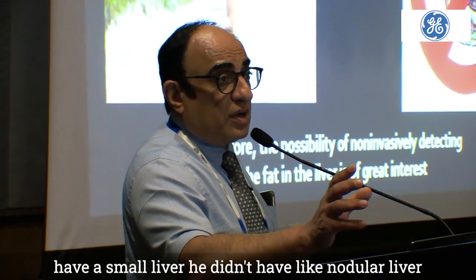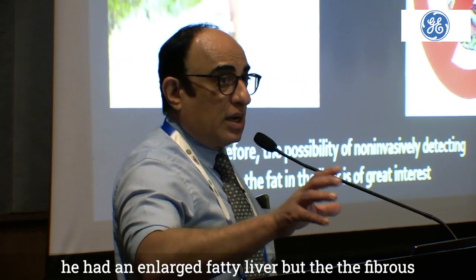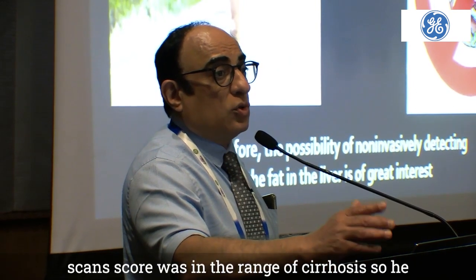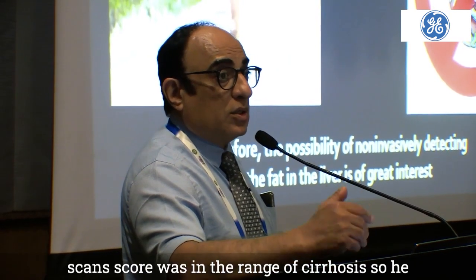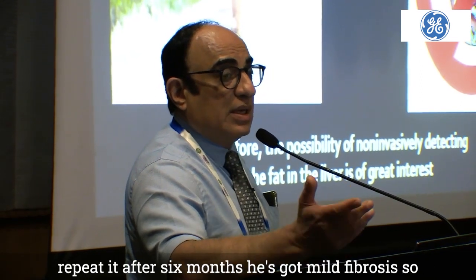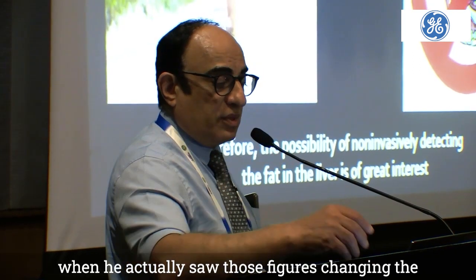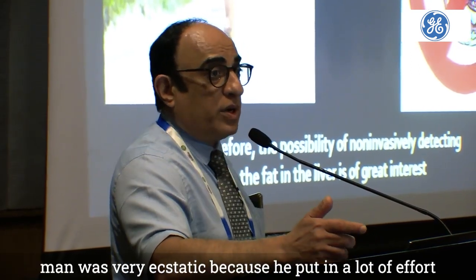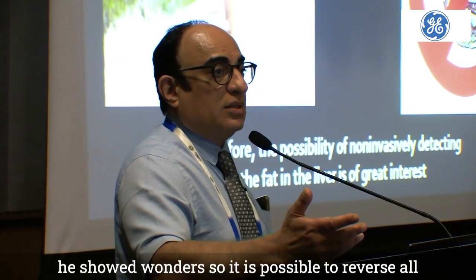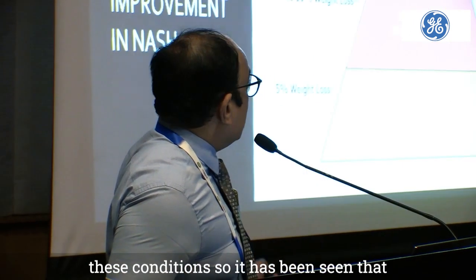He didn't have a small liver. He didn't have like nodular liver. He had an enlarged fatty liver, but the fibroscan score was in the range of cirrhosis. So he already had chronic liver disease. And today, when we repeated after 6 months, he's got mild fibrosis. So when he actually saw those figures changing, the man was very ecstatic because he put in a lot of effort with diet counseling, exercise, and in 6 months, he showed wonders. So it is possible to reverse all these conditions.